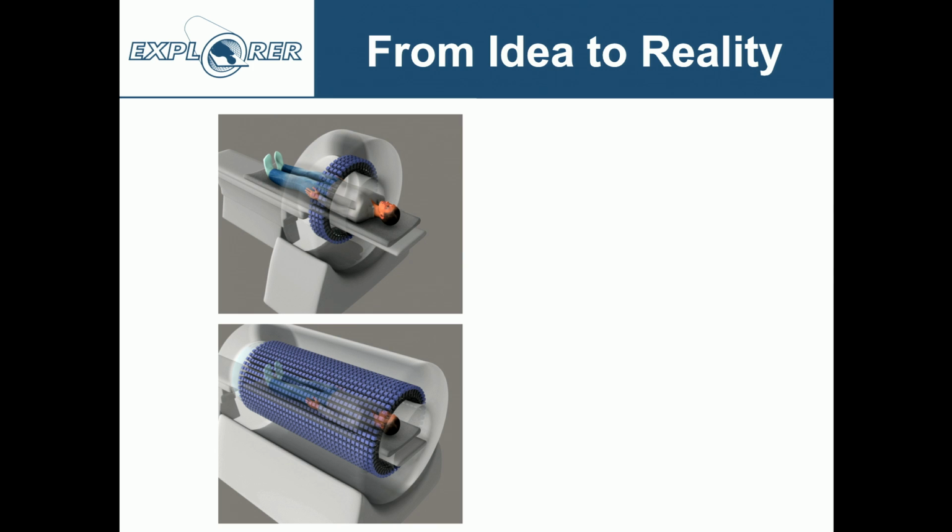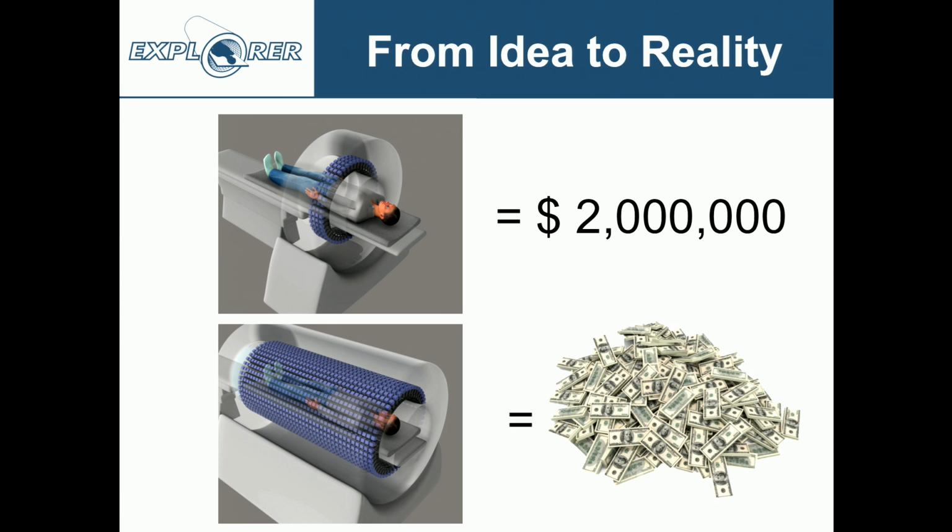So now the question is, how do we get from an idea, which on paper looks reasonably plausible, simulation data looks quite encouraging, how do we actually prove that this is going to change the way that we use PET both in research and eventually in the clinic? And so if you go buy a PET-CT scanner today, we can quibble about the numbers, but you're roughly in the $2 million kind of range. And so the big question is, what's this guy going to cost? And how do we get enough funding to actually build an initial prototype to actually demonstrate those performance gains that we've been talking about?